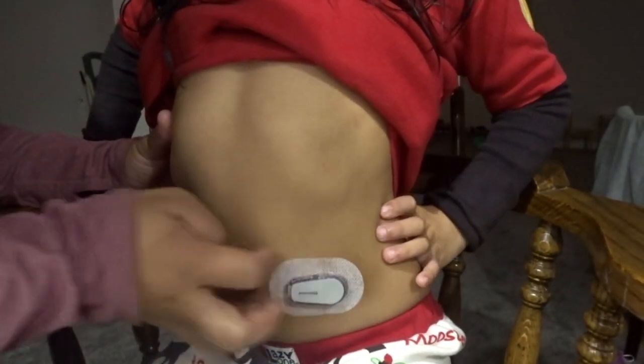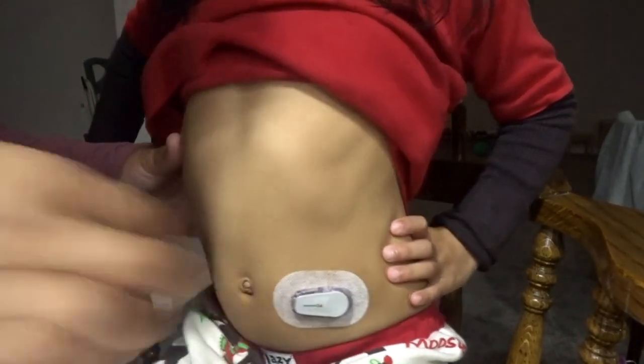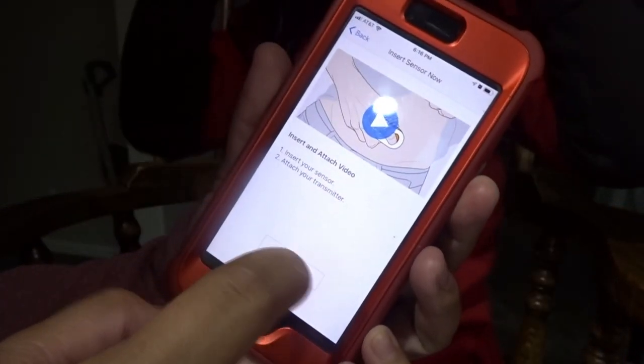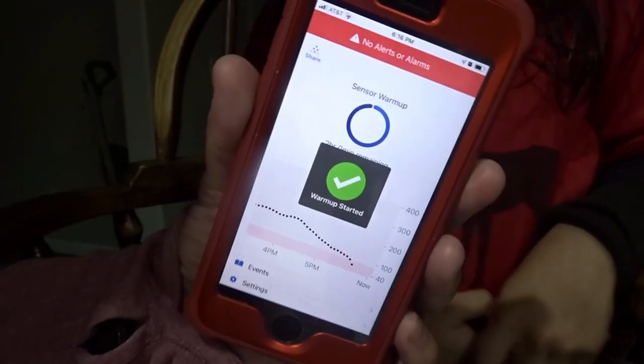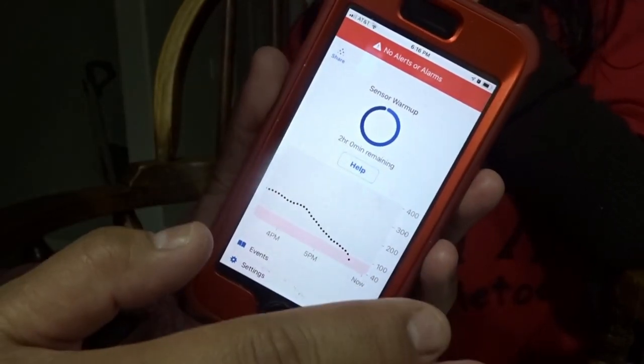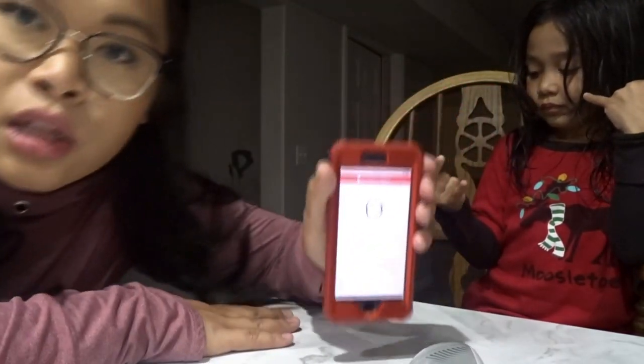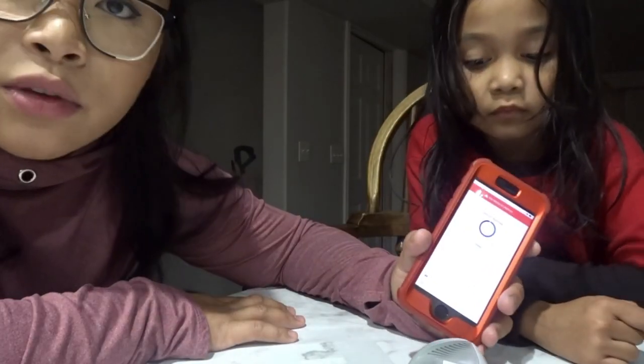That is done! Now we're going to go back to the receiver, press Next, and press Start Sensor. You're now on a two-hour warm-up, so you're not going to get any alerts or anything like that. We actually have to check her sugar because it says it was going down. Make sure the receiver is close to you or it's going to give you an error.